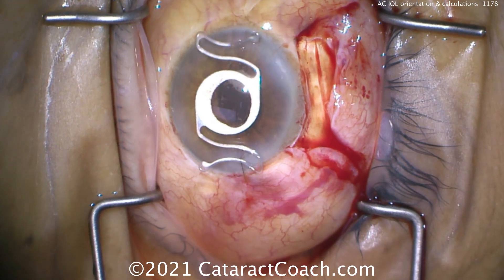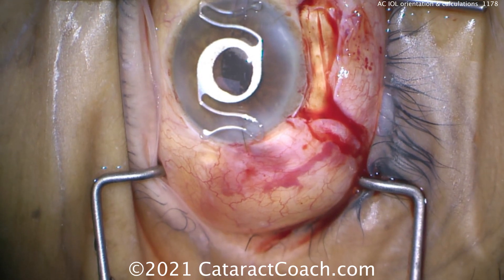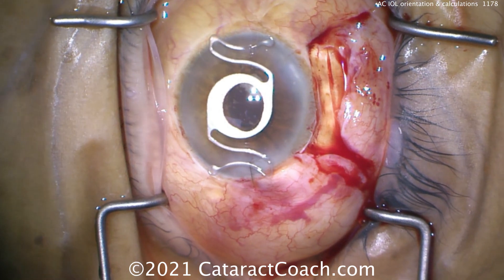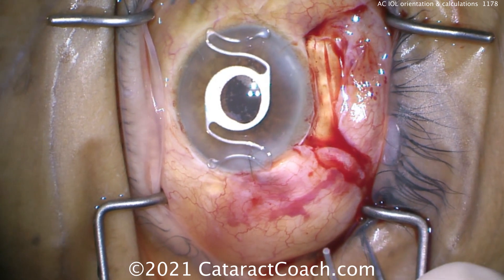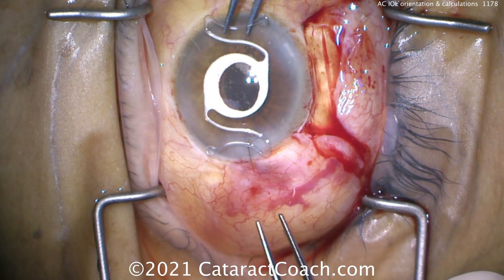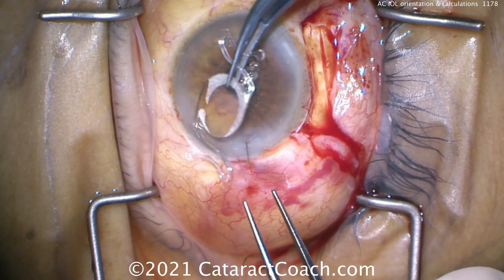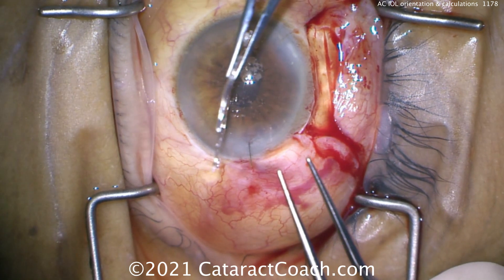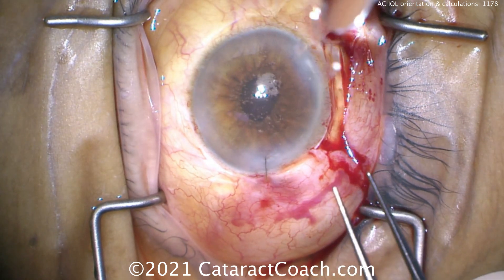This lens is also anteriorly vaulted. What does that mean? It means the lens is not planar — it's not totally flat. There is an angulation where the center part of the optic is slightly vaulted above the plane of the haptics. If you grab the lens and tilt it on the side, you'll see that. An AC lens, an anterior chamber lens, is actually angle-supported. You need those footplates in the angle, and the iris-pupil zone is actually slightly above it. There's the anterior vault — you can see it's not totally planar. The correct orientation has it vaulted away, above the pupil.